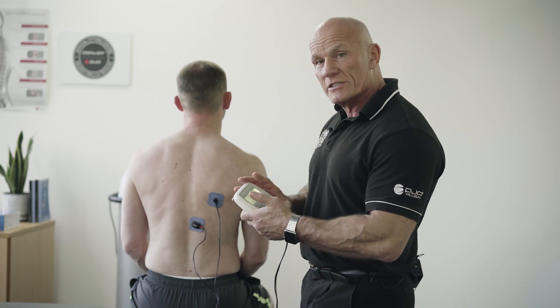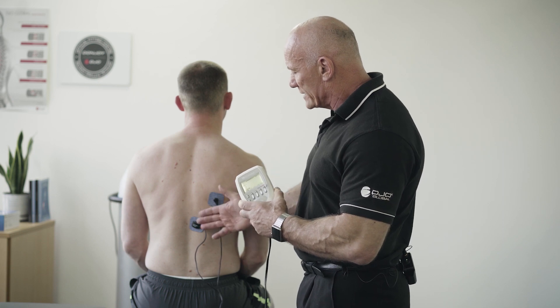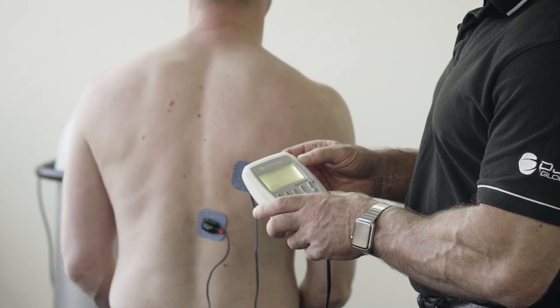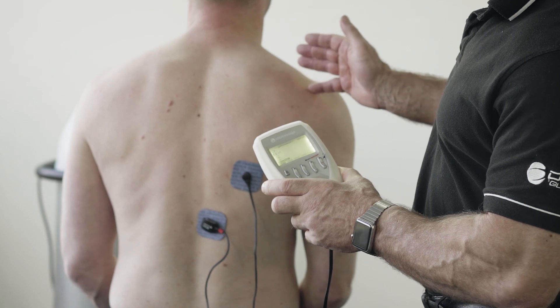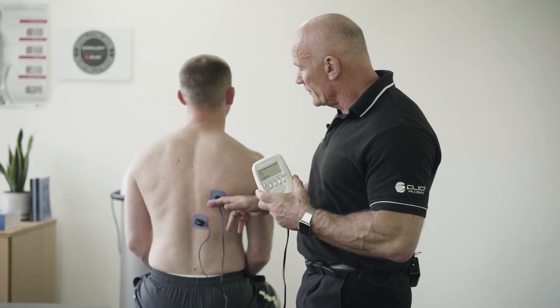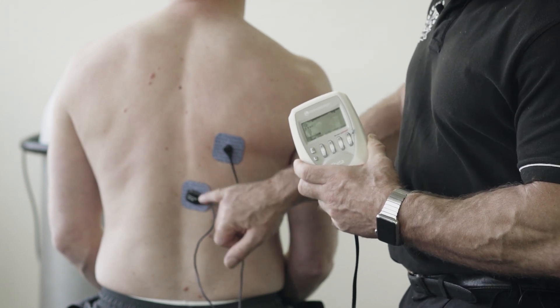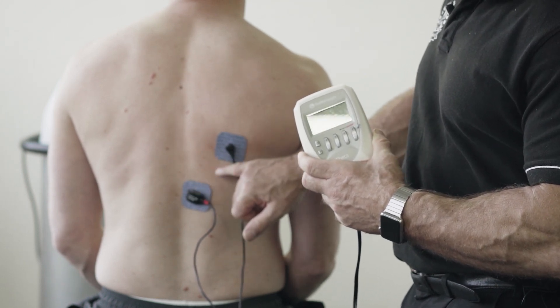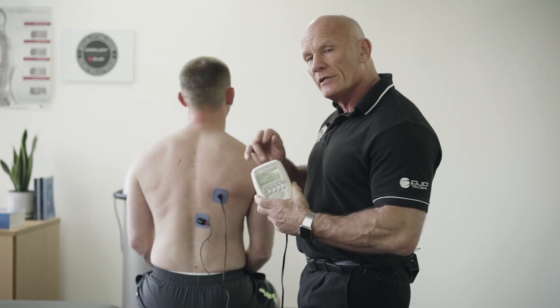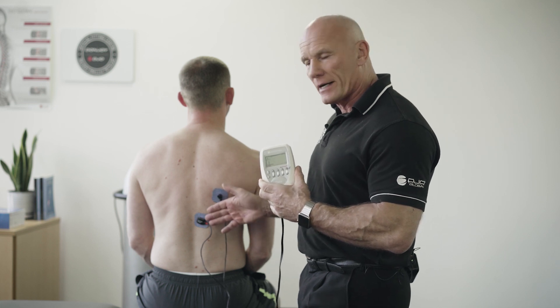On the first session we do this, it allows the patient to understand what type of movement they need to produce. On the second session, I ask the patient to replicate this movement by recruiting the lower trapezius, and when the sensor picks up that this muscle contracts, it rewards him with a muscle stim. Hence we get the biofeedback.